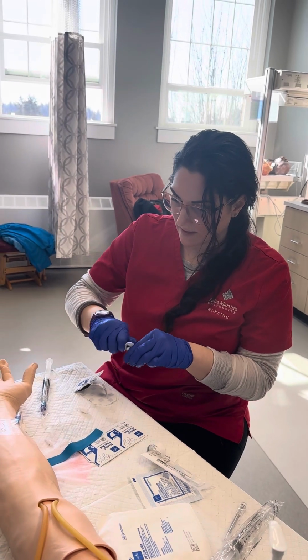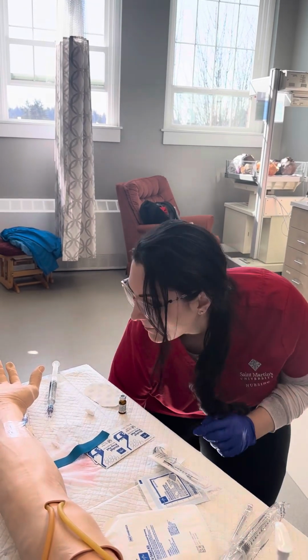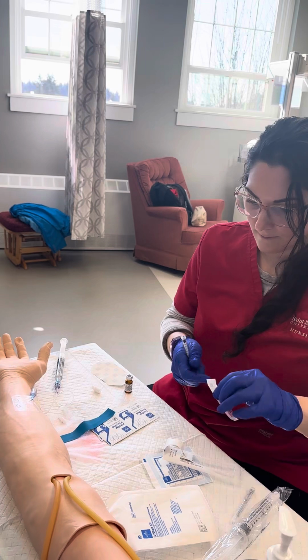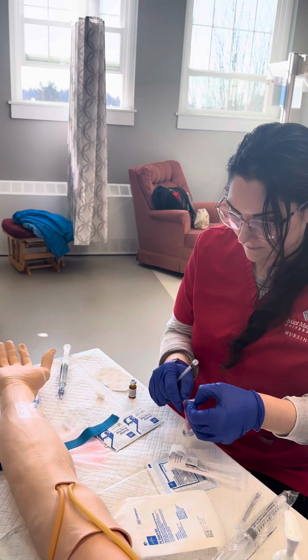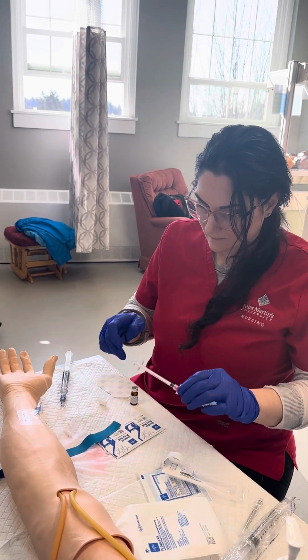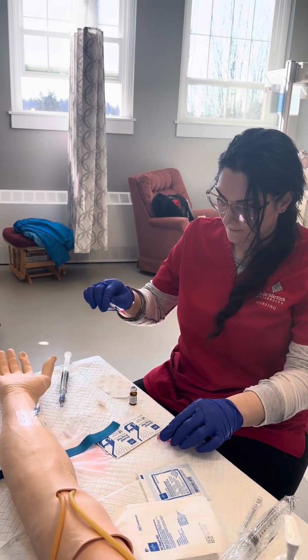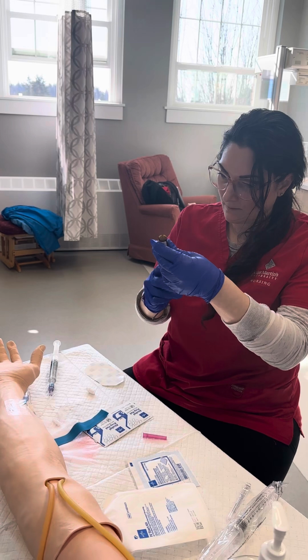Clean this off, 15 seconds. Okay, so we're going to be doing 0.3, the morphine.